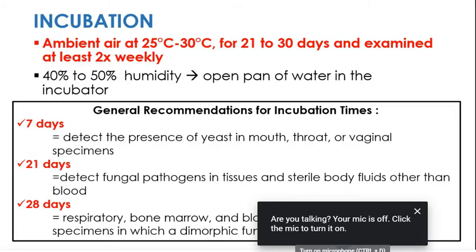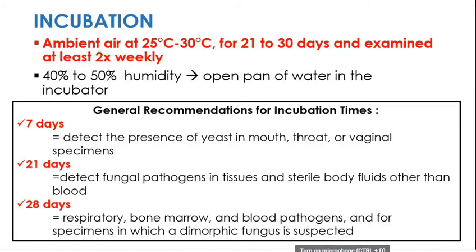Okay? So, incubation. Again, let's get into the temperatures. You have your 25 to 30 for 21 to 30 days and examine at least twice weekly. Anong sinagot nyo sa multiple choice kanina? Kung gaano katagal dapat ang culture media nyo bago nyo i-dispose o bago nyo sabihin no growth? Ilan ang sumagot ng 72? 72 hours, 2 weeks.